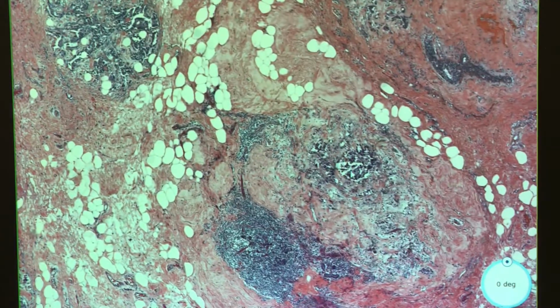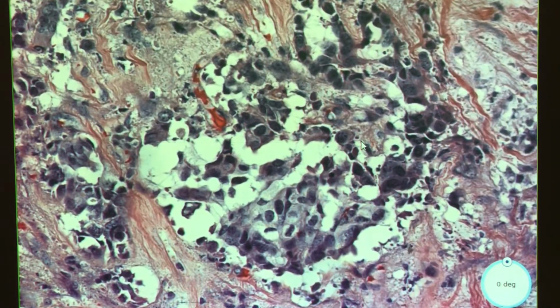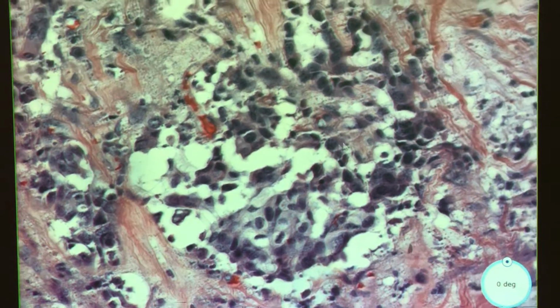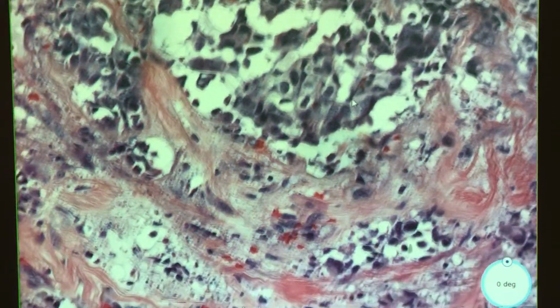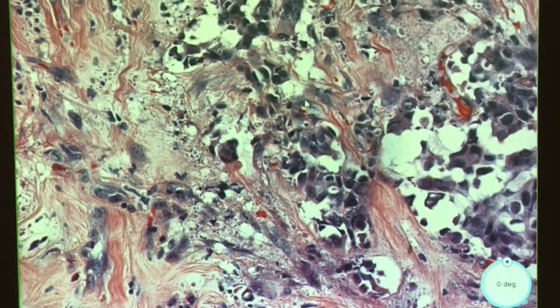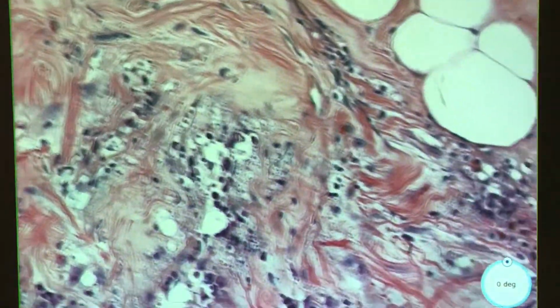That is something that you can do in the Path Presenter system. If you want to annotate slides, you can do so. Okay. Well, I'm seeing like there's a few mitotic figures. But this thing is so ugly. I have a feeling I called this one a grade 3 when I first looked at it.